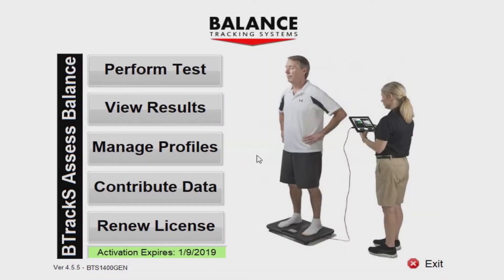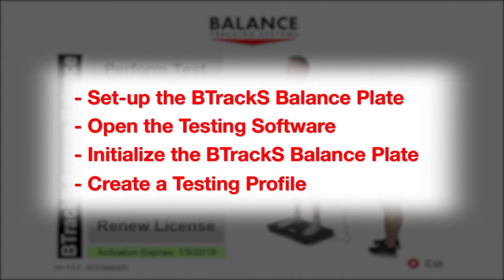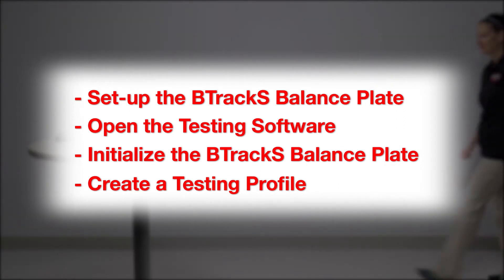Welcome to the B-Tracks Testing Setup Overview video. In this video, you will learn how to set up the B-Tracks Balance Plate, open the testing software, initialize the plate, and create a testing profile.